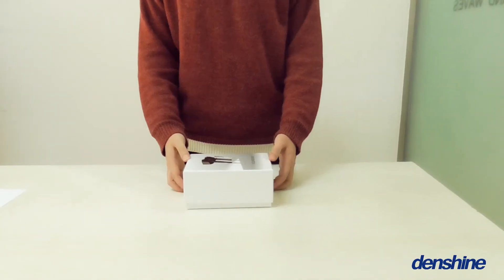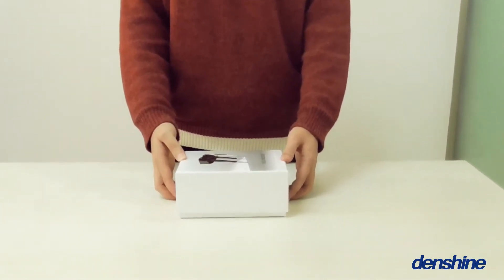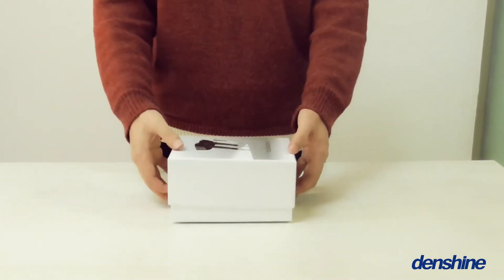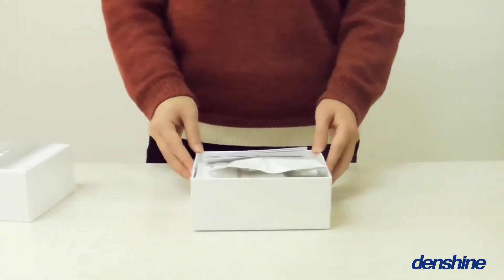Hi guys, long time no see. Welcome to Densha again. Today we got to introduce our supermodel product, LD Wireless Endo Motor. This time I will show you this from the next three weeks.